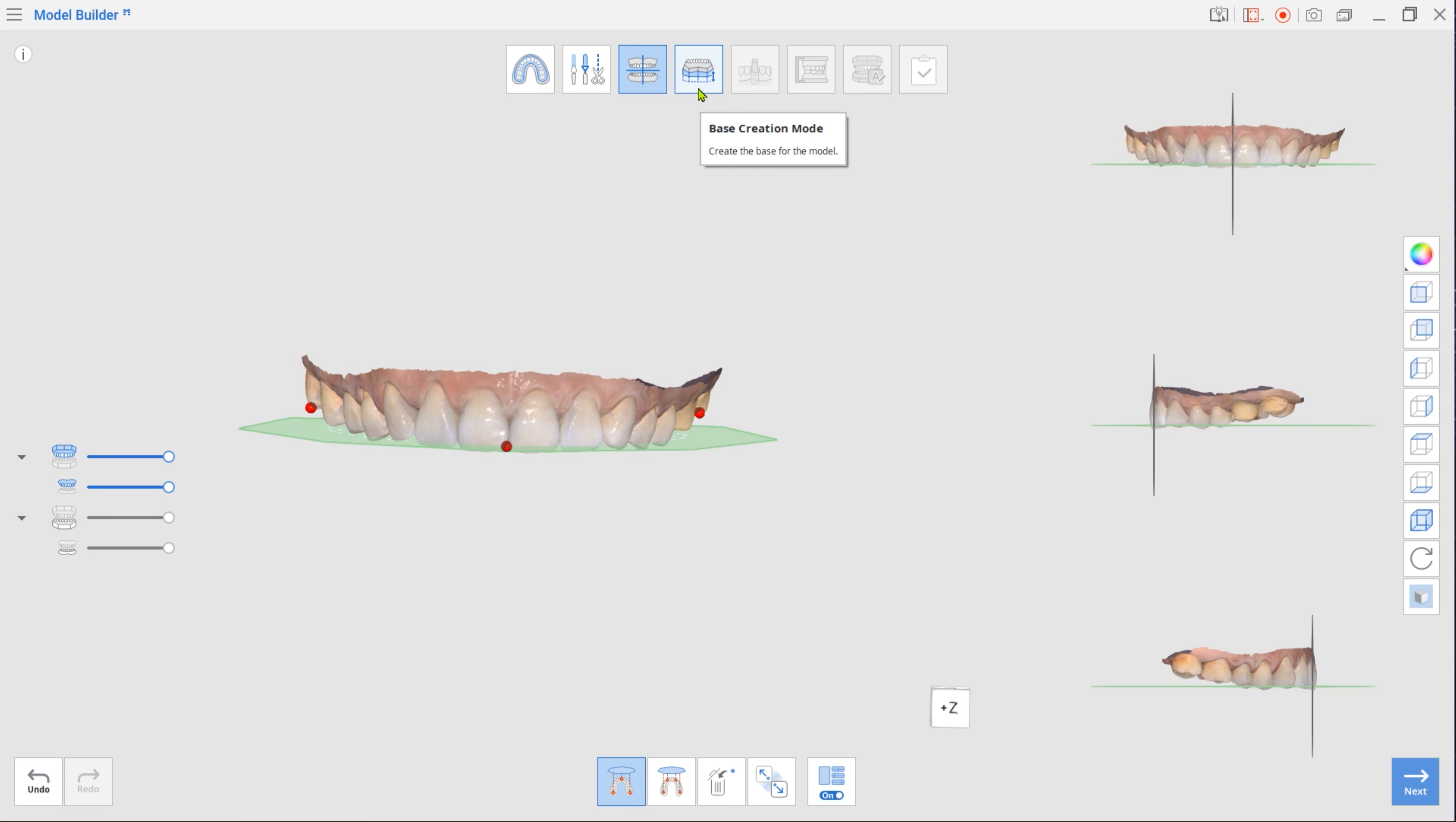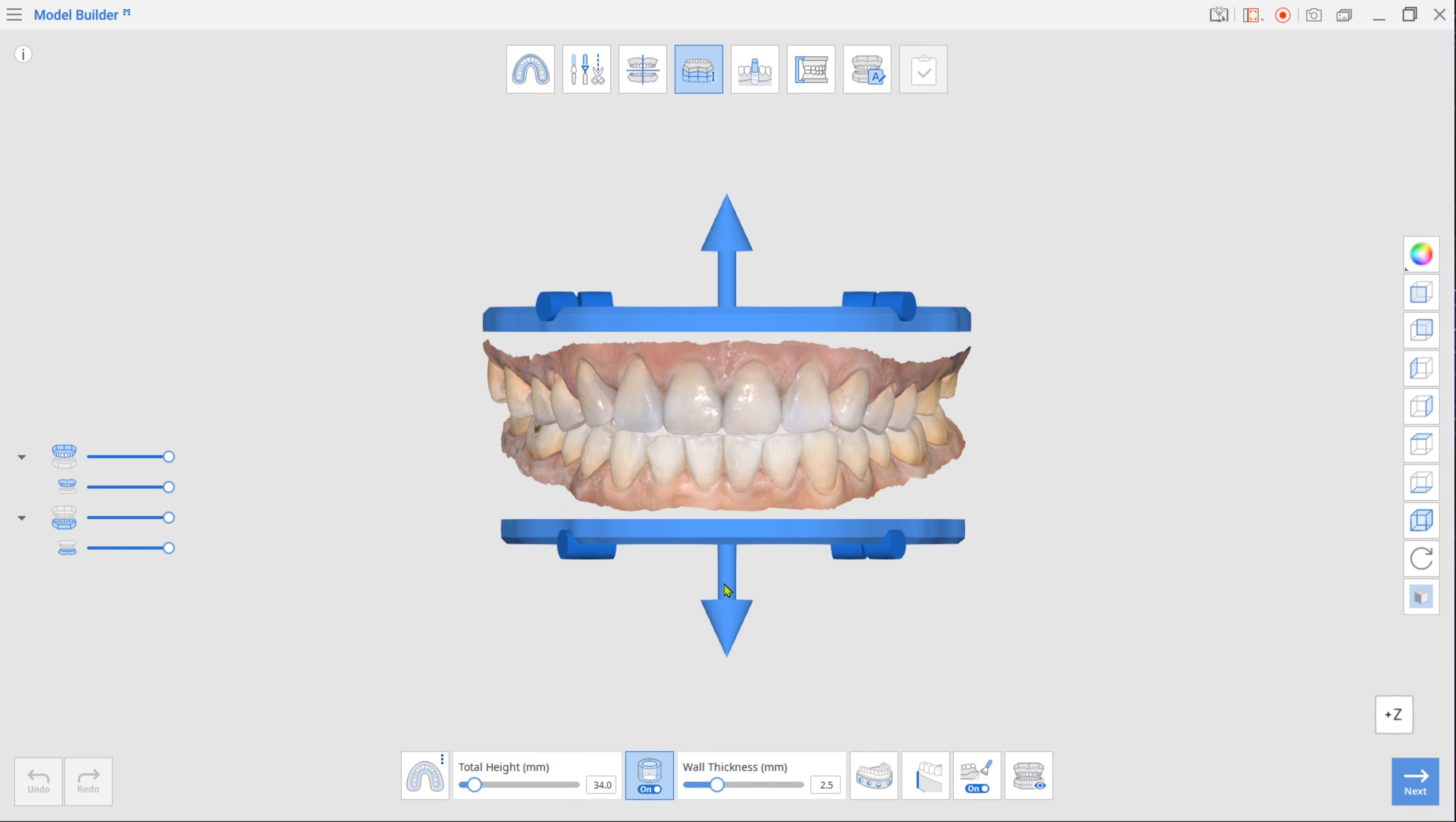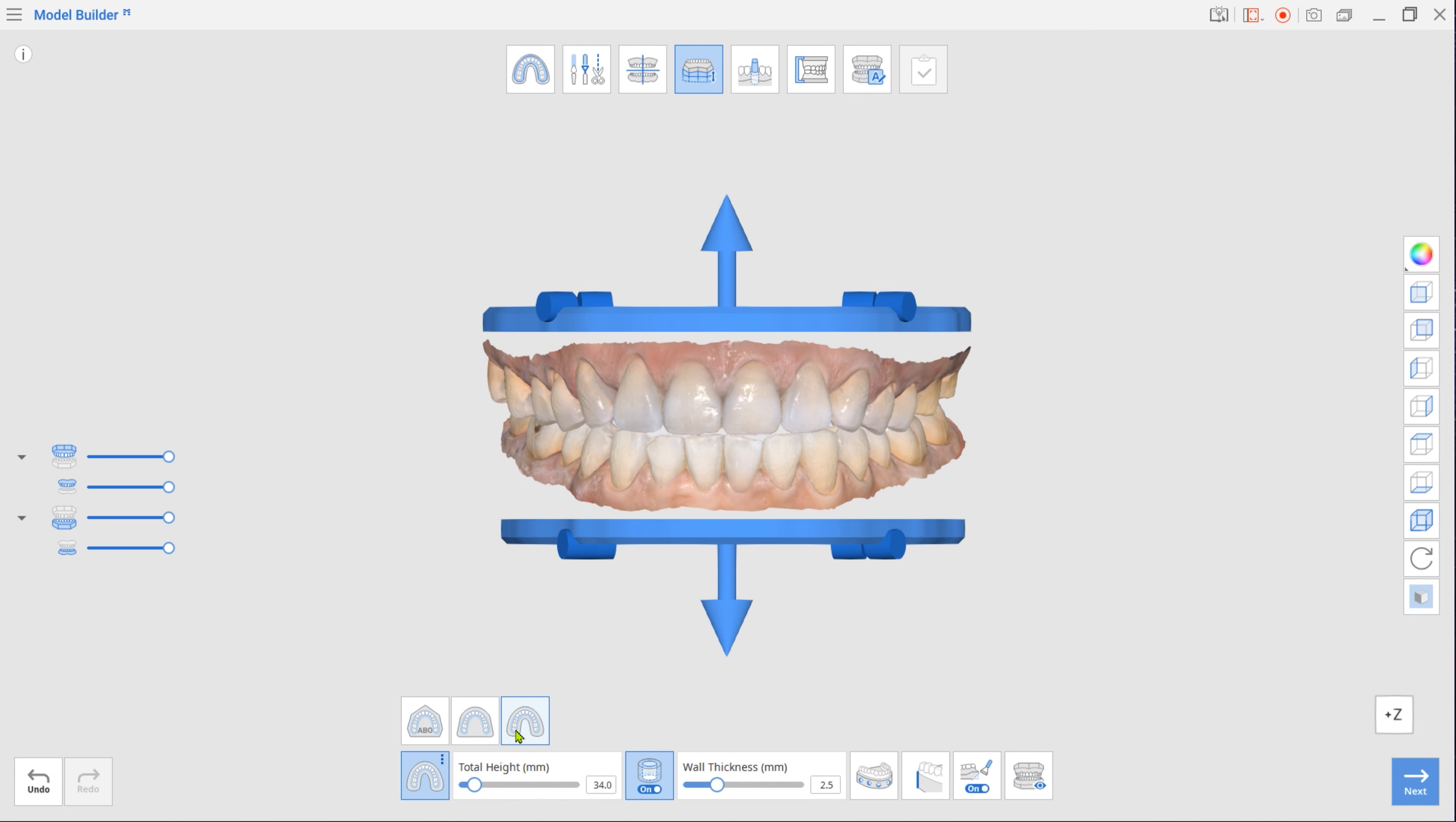Next is Base Creation mode. Drag arrows up or down to adjust the base height and select Plateless Model as the base type in the toolbox. To minimize consumption of resin material during printing, leave the hollow shape option on.